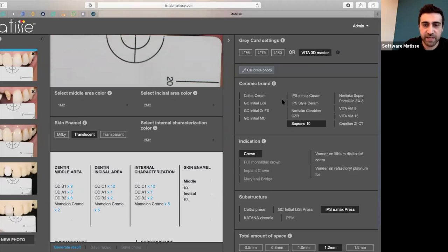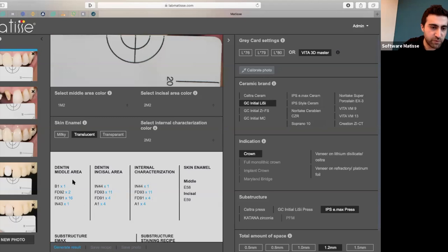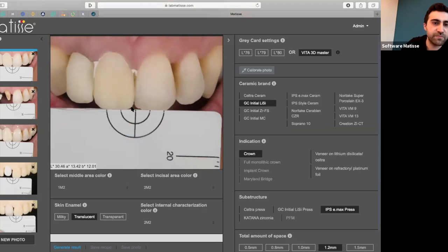You will get a mix to replicate the Vita 3D Master shade tab. This recipe is adjusted for Vita 3D Master. This mix will replicate this color, this recipe for shade 1M2. The only thing you must have is that the dentist is able to choose the correct colors of the tooth with Vita 3D Master.